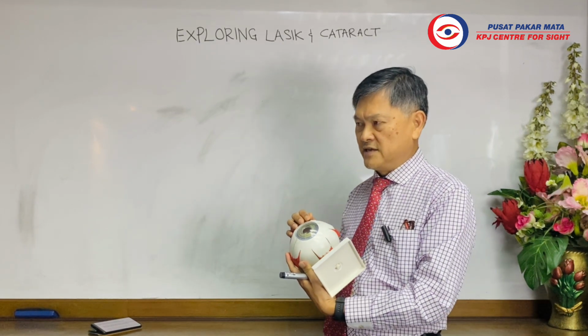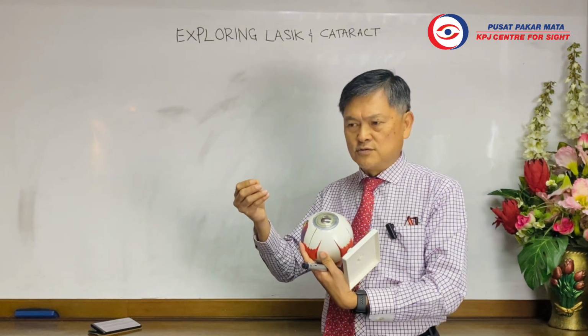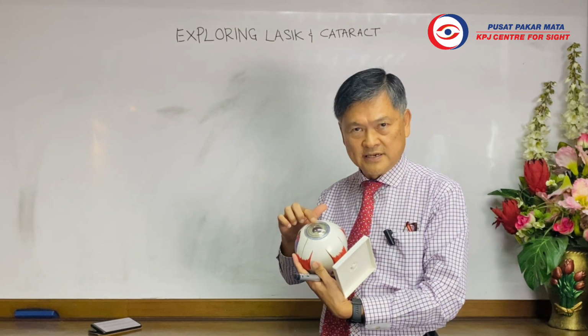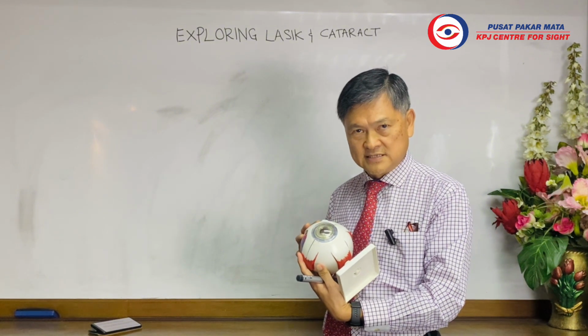Okay, let's say for instance, short-sighted people need to wear glasses. So instead of using glasses to change the power, the laser will change the power on the cornea, so that patients after the laser do not have to wear glasses.